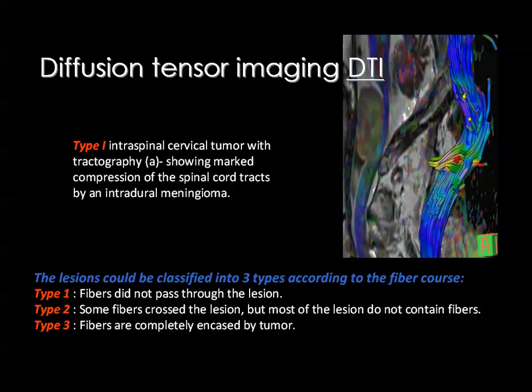And factors favoring astrocytoma may be the younger age of the patient, maybe the cystic component and the solid component of the lesion, maybe the long segment of the spinal cord involvement by the tumor compared to the ependymoma. But you should remember that it may be impossible to separate the two lesions based on imaging.